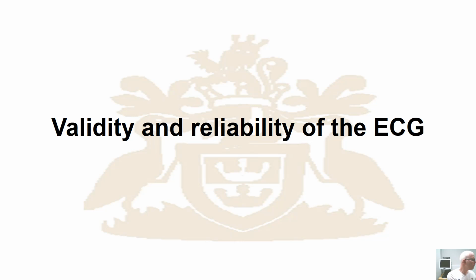So they're kind of obvious responses that we see. But in order to satisfy ourselves that those are typical responses, that we can be certain they are appropriate responses and that they're not artifacts of noise, we need to be certain about the validity and reliability of the ECG signal that we're recording.